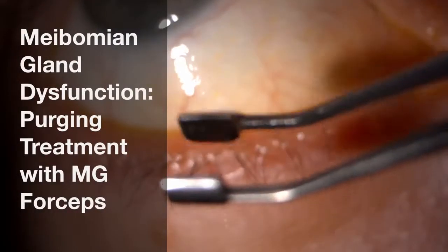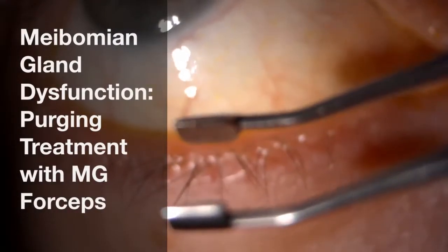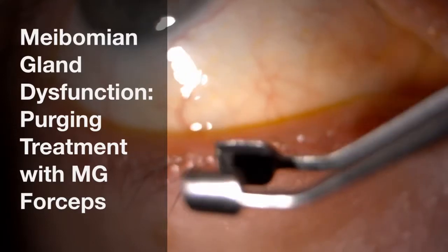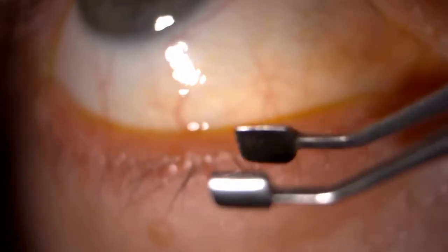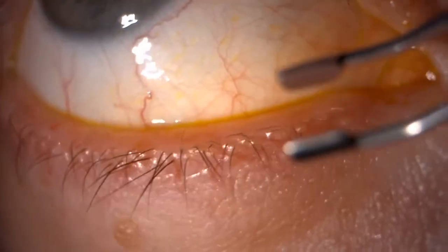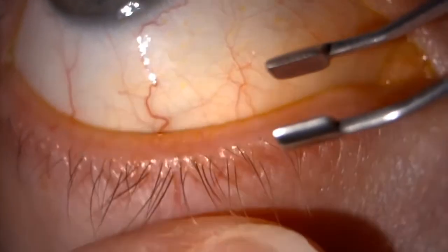We really use meibomian gland forceps both in terms of helping to diagnose the underlying condition and also therapeutically to treat it by purging out the contents of the blocked glands.